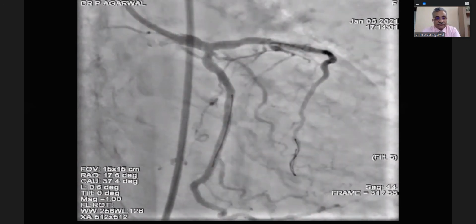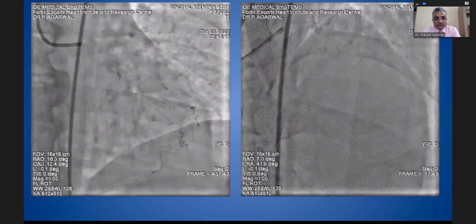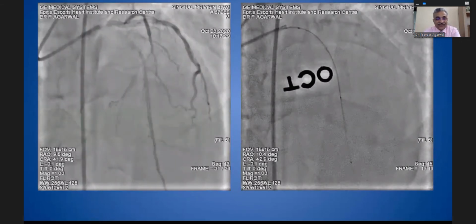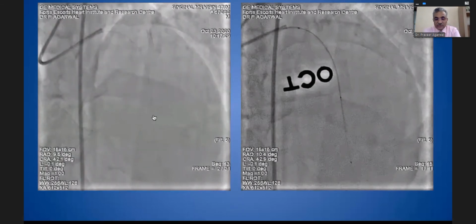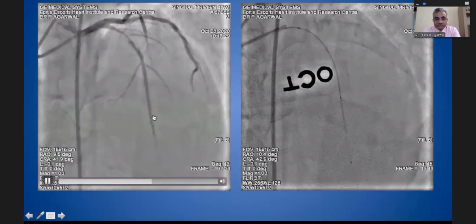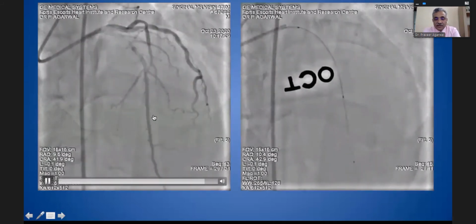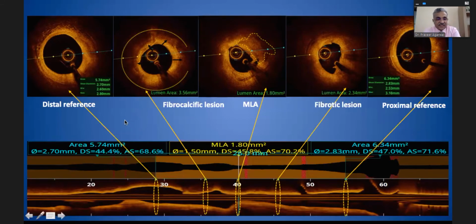Now see this patient. It's a lesion in a young patient, about 47 years old, and all these are diabetics, they have fibrotic lesions. So the OCT run. Initially, it would look like just go with the balloon and come out to this end. The OCT is useful. The lesion is mainly fibrotic, and there's some calcium also sitting here. It's a good fibrotic lesion.